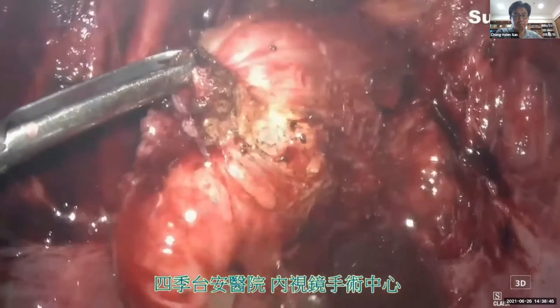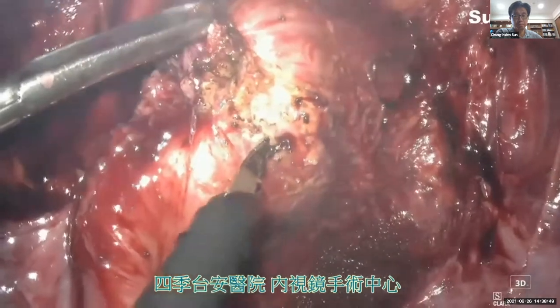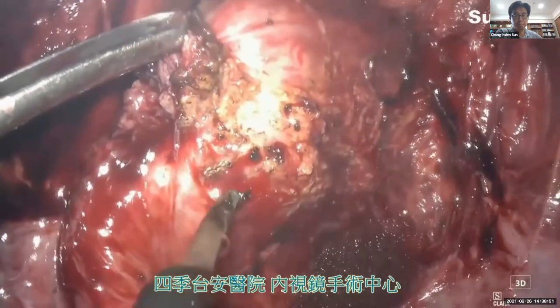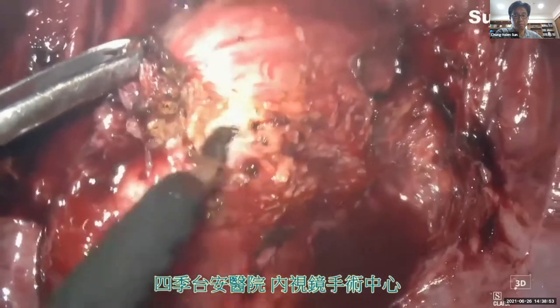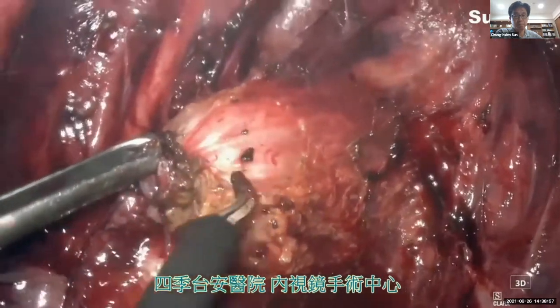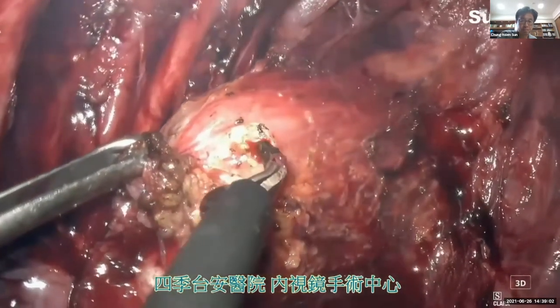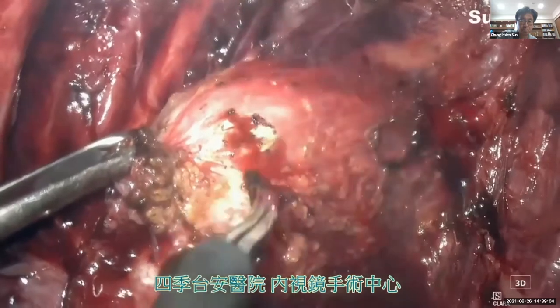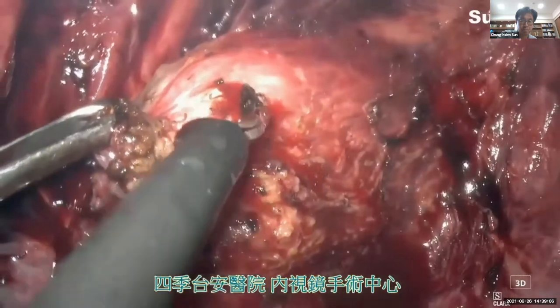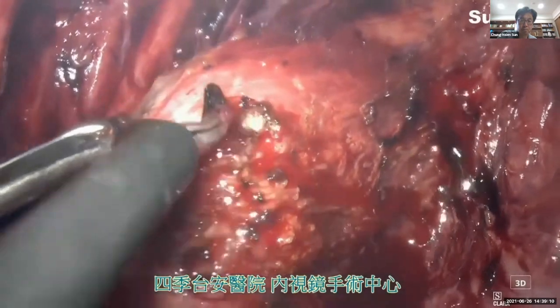And if we see bleeding like this, then we know we have already cut into the outer longitudinal muscle layer. So be careful. Okay, again, instrument palpation to figure out the margin of the DIE nodule. We are cutting the outer longitudinal muscle.